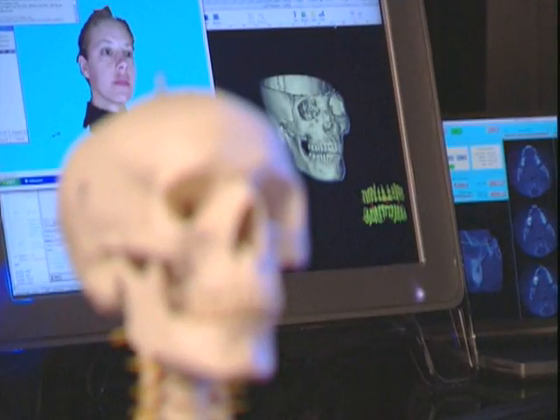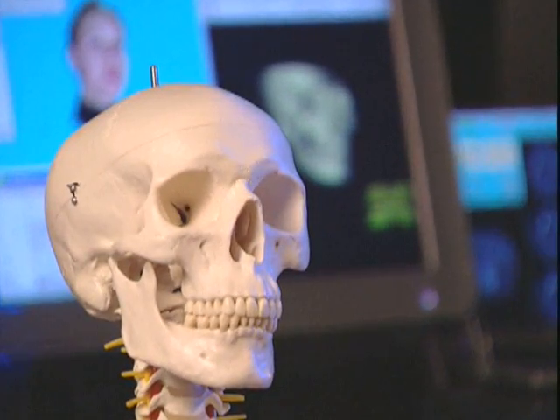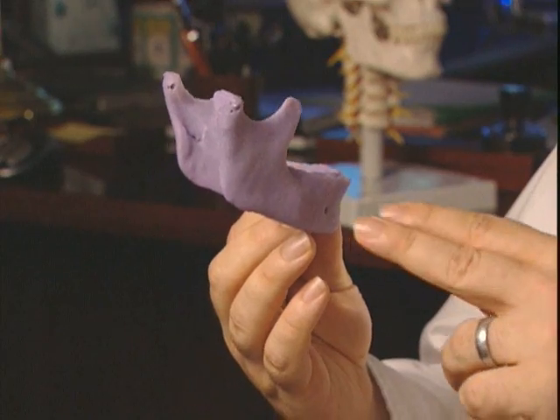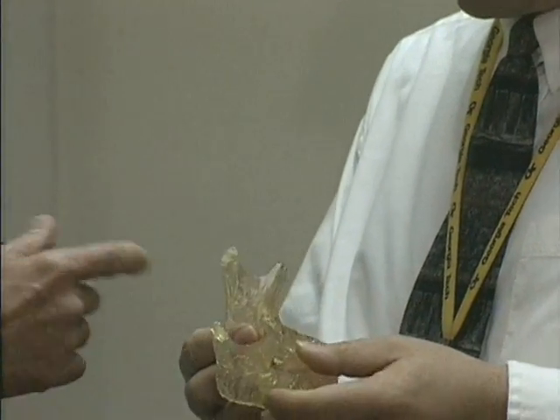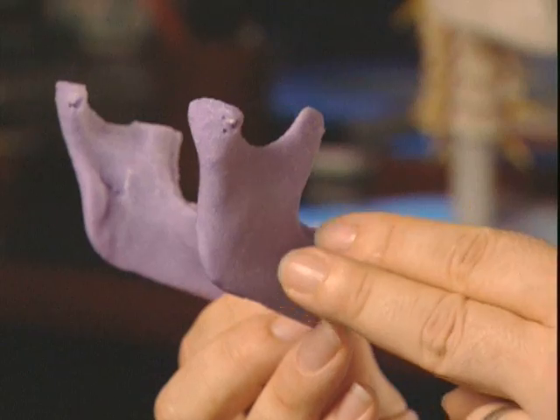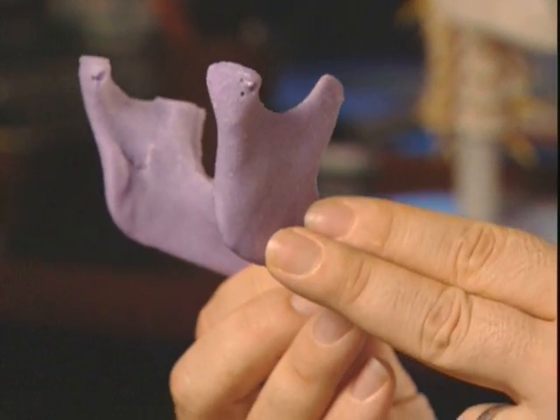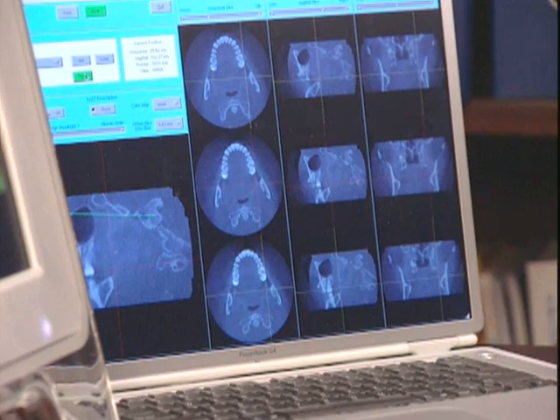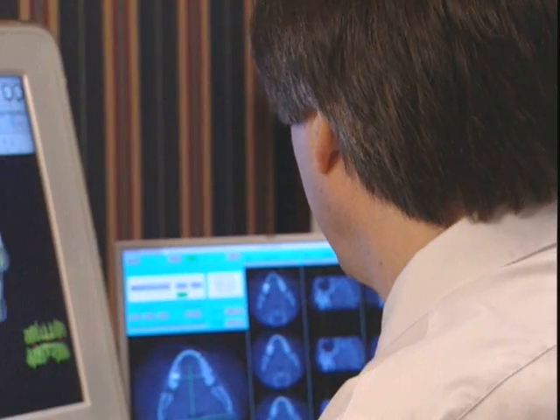As part of our creation of 3-dimensional images using computed tomography, we can support craniofacial surgery by developing rapid prototype models, in this case a mandible, where we remove the teeth and just have the mandible, and we can then give them to the surgeon where they can go in pre-surgery and do a test of their technique by cutting on the model, installing the prosthetic device before they ever go in and work on the patient. And what we've done is provided methods for doing this that has reduced surgery time down from about 8 hours for a standard joint replacement surgery to about 3 hours.